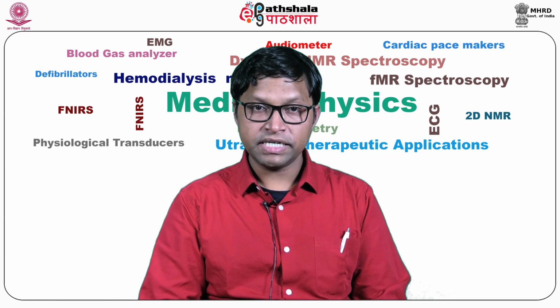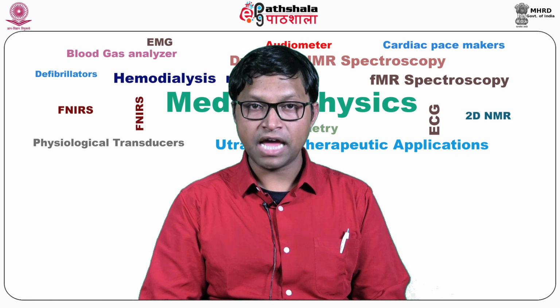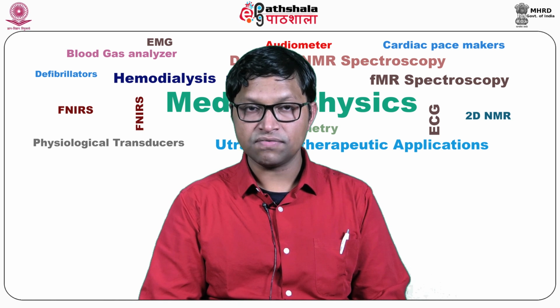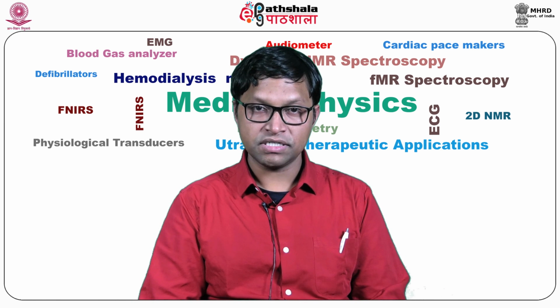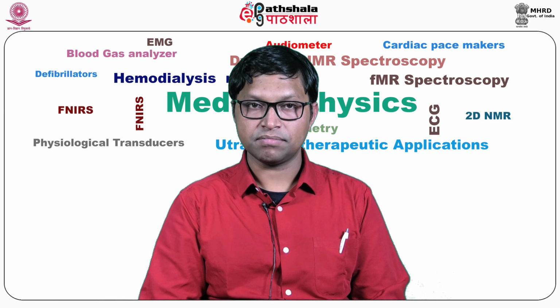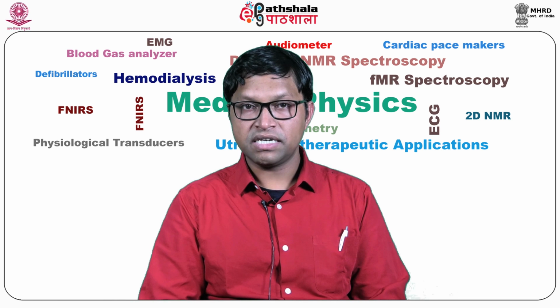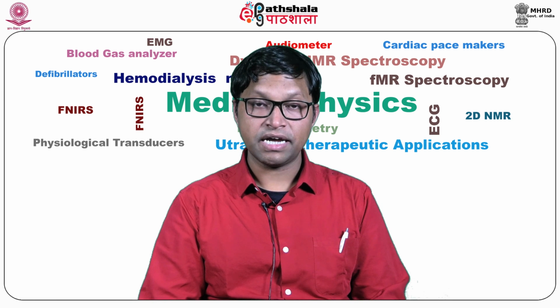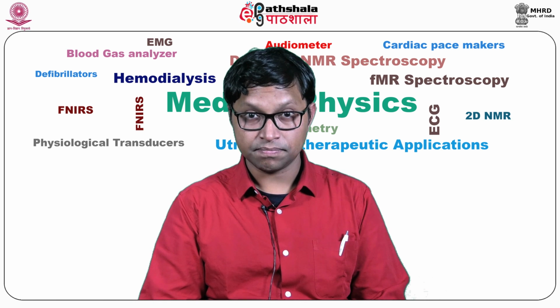The next component of the EMG machine or the instrument is the amplifier. It is a high gain amplifier which has a selectivity for frequencies from 10 to 5000 Hertz. The third component of this system is the recording system. In any design of an EMG signal acquisition system, three principal requirements must be kept in mind. The front end interfaces the analog input signal to the analog to digital converter system.